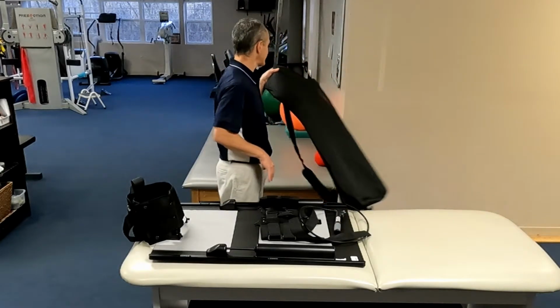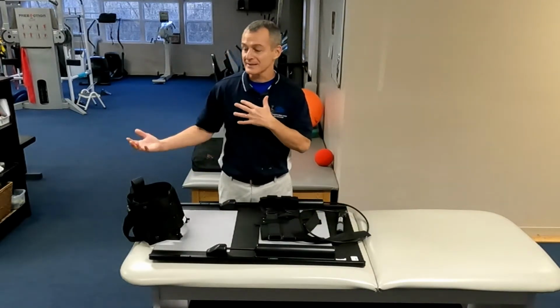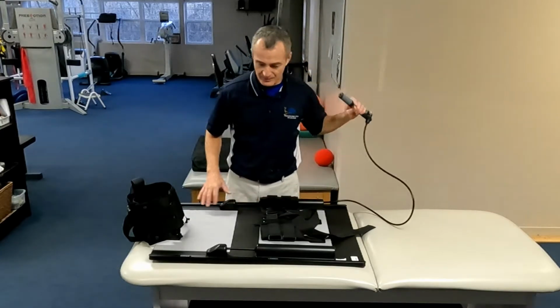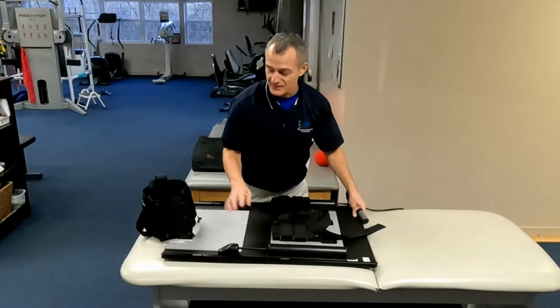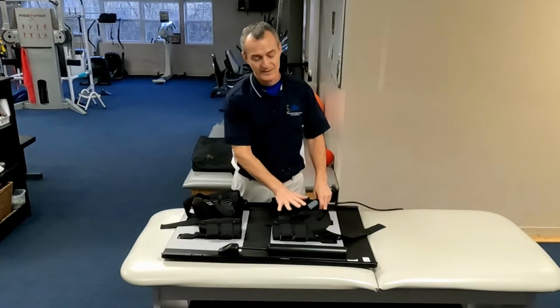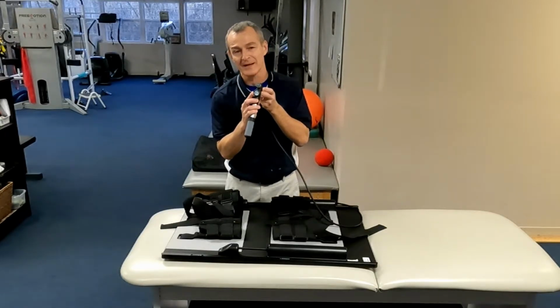So let's take a look at some of the basic features, how lumbar traction works, what lumbar traction does, what it doesn't do, and then we'll actually get on the floor and we'll use the device. I'll show you how I set it up if I was going to use it. But essentially what happens here, we have the individual, there's a label here where it says upper and lower. So the person's going to be laying their head up here, their feet down here, face up. This is going to go over the abdomen, torso. This is going to go over the hips and the pelvis. And what we've got is we've got our pump. There's a little gauge on the pump to show you how much pressure.